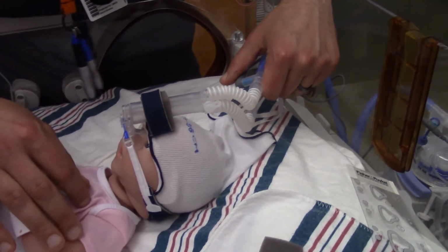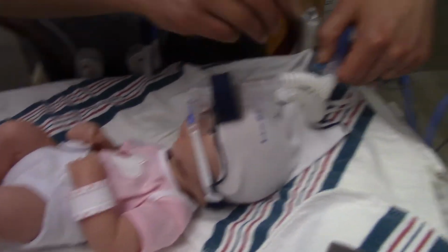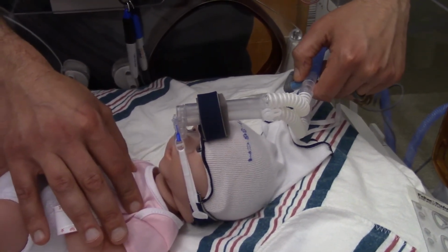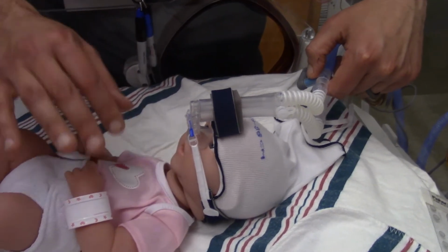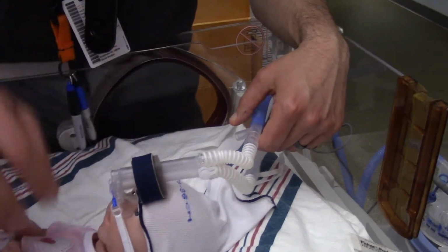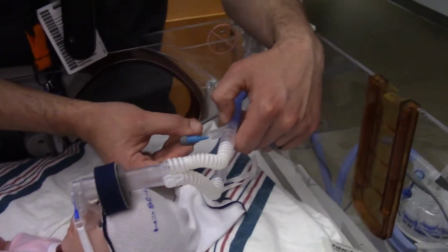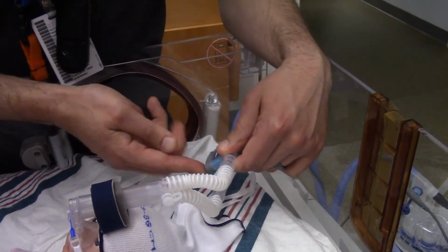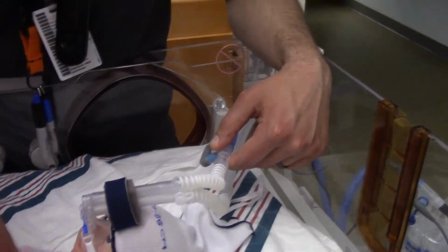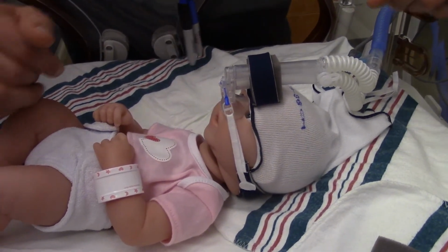Another way, when nurses are listening for murmurs and heart sounds, belly tones, all of that stuff, if you've got a good seal, you've heard the bubble in the chest, it's almost impossible, if not impossible, to hear good heart sounds. Don't be afraid to take that out for a second and auscultate and listen for your heart sounds, your belly sounds, anything else you need to do. Just remember that needs to go firmly back into the circuit and hear the bubble again. Once you're done and this is back in, quickly auscultate the lungs, ensure that you've got a bubble going and the baby's getting the therapy.